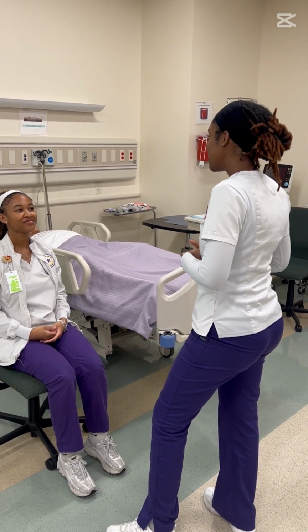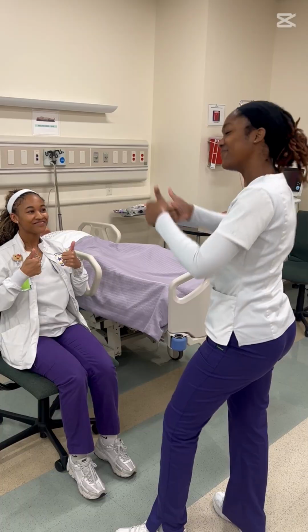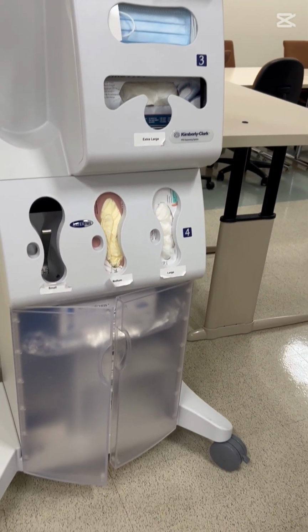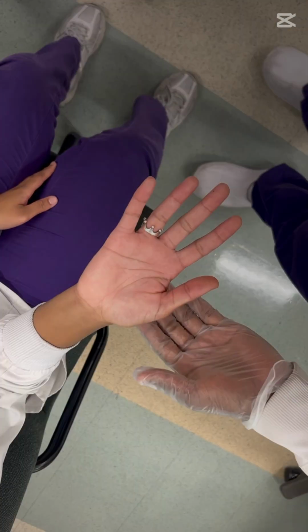So we'll be going over the indications for an ABG, which include respiratory failure, chronic obstructive pulmonary disorder exacerbation, suspected metabolic acidosis, and evaluation of oxygen therapy, as well as the contraindications, which include bleeding disorders, peripheral vascular disease, Raynaud's phenomenon, and most importantly, lack of dual artery supply, which we will assess during the Allen's test.